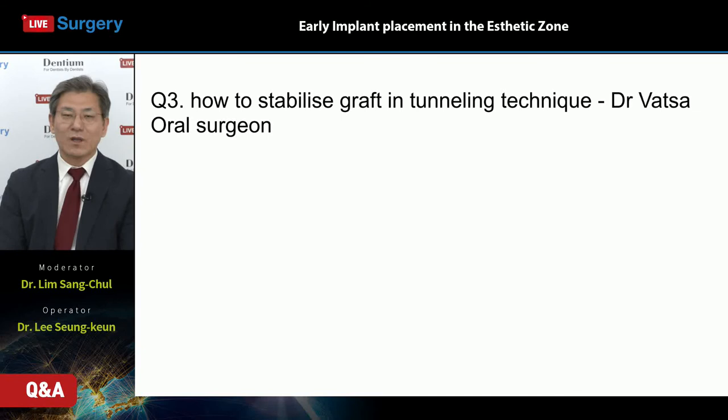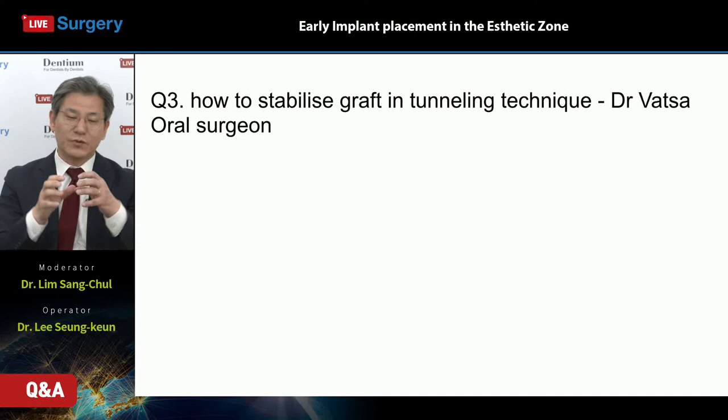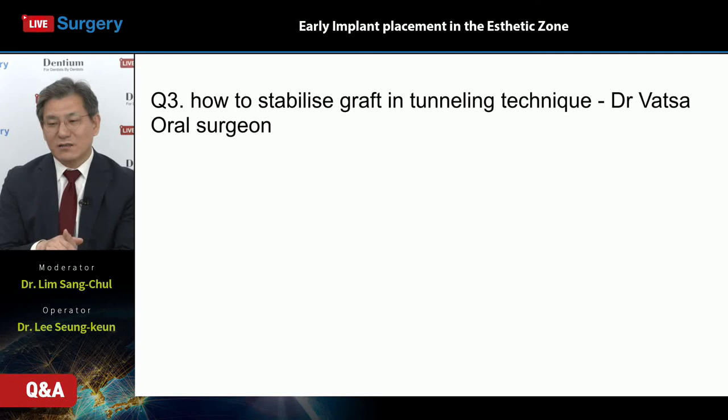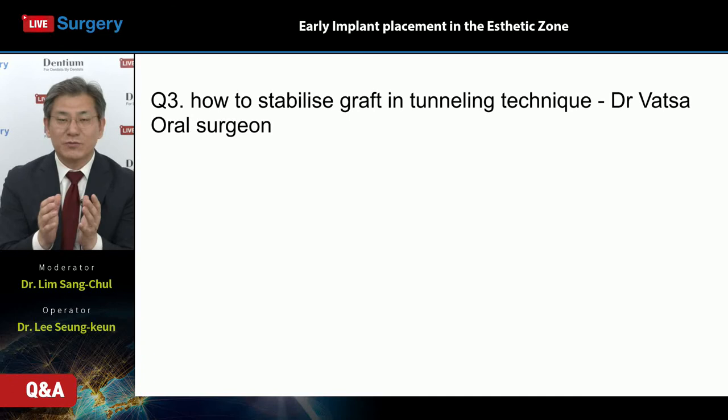Let's think about an envelope, right? One part, make a vertical incision, like a total envelope situation. Just put the graft material into this envelope, and the graft material is automatically held inside of it. So Dr. Lee prepared to use a graft material like Osteon 3 Collagen, a self-containing, self-holding graft material. It is not scattered, and the holding capacity is higher than just grafted material, right? Osteon 3, Osteon 3 Block, Osteon 3 Collagen, what is better? I think Osteon 3 Collagen is a better graft material for the envelope technique, okay?